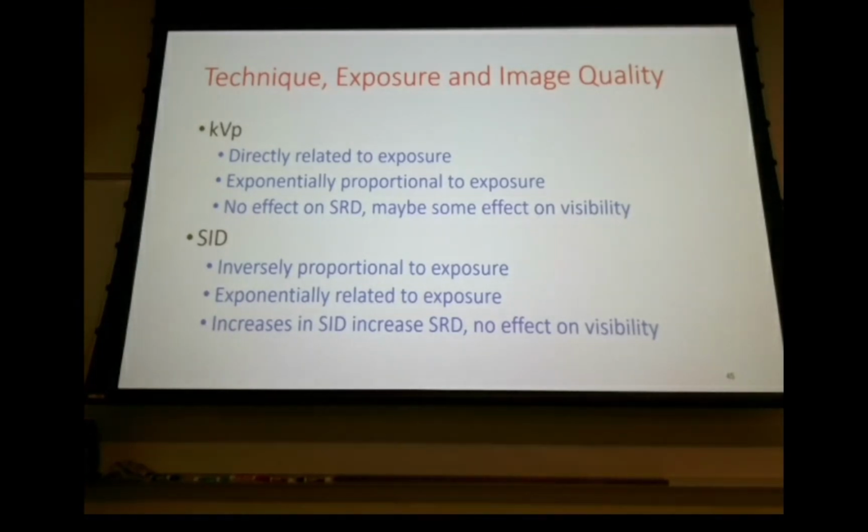Remember, in image quality, we have two things. There's contrast resolution and spatial resolution. Spatial resolution is your sharpness or recorded detail. Contrast resolution is just a difference in density.